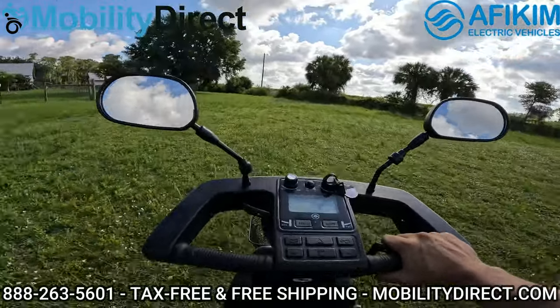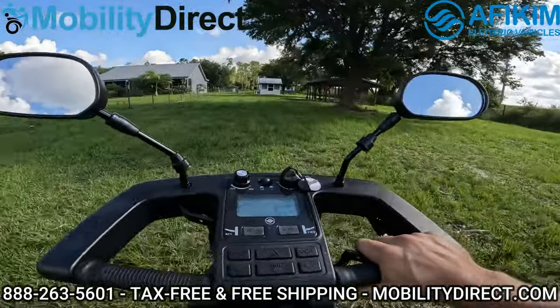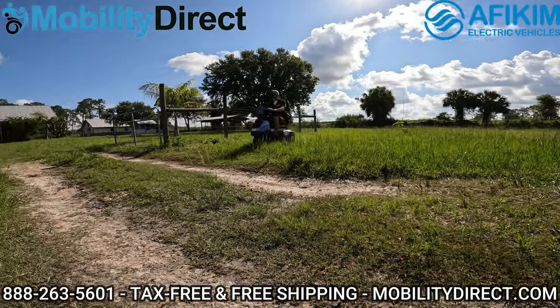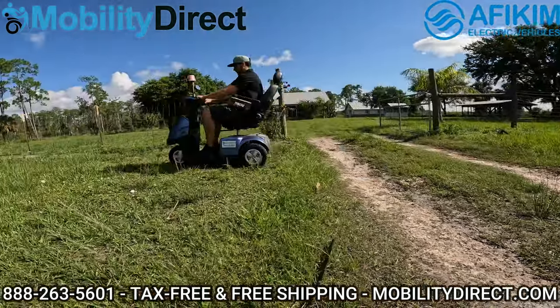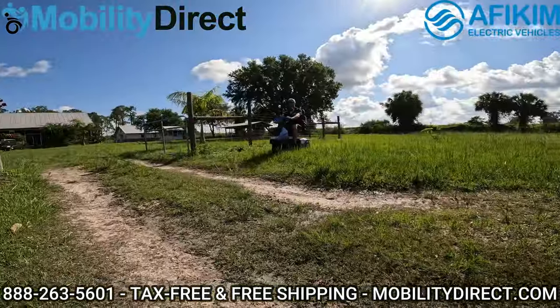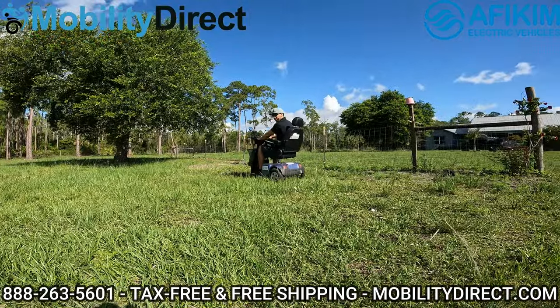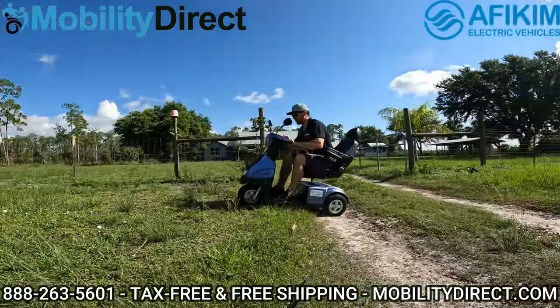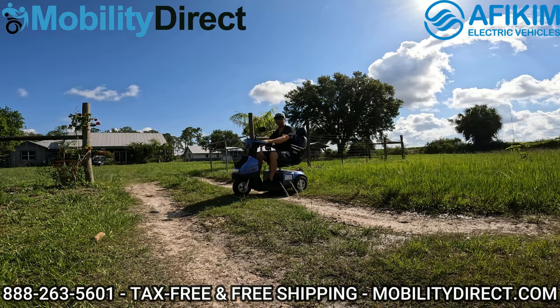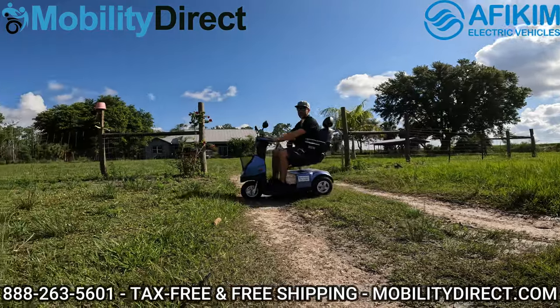So we're going to go on a little ride — it might get a little bumpy, but it can hang. From a different angle, we're going to show you these two dips here. I barely even felt that. With the big tires and the full suspension, it's really handling it great. Even from a dead standstill, a lot of mobility scooters will not be able to get up out of a ditch like this — not the Afikim.